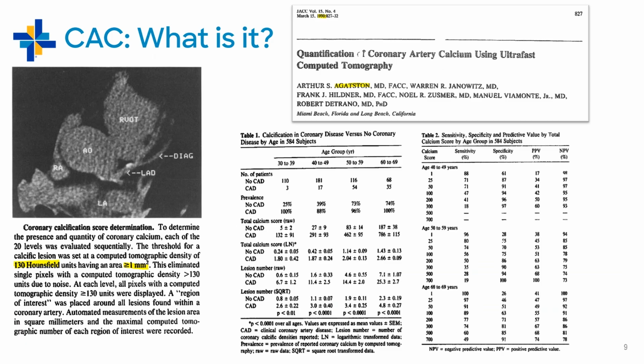Dr. Arthur Agatston used CT scans, which are exquisitely sensitive for coronary calcium, and actually did scans on hundreds and then thousands of subjects looking to see what the distribution of calcium was. And as it turned out, as you got older, whether you're a man or a woman, your calcium score tended to be higher as your age increased. And here you can see one of the early scans. This is an area of calcification.